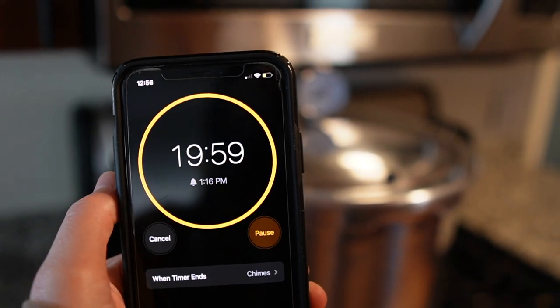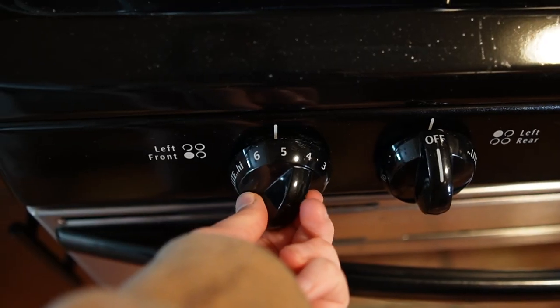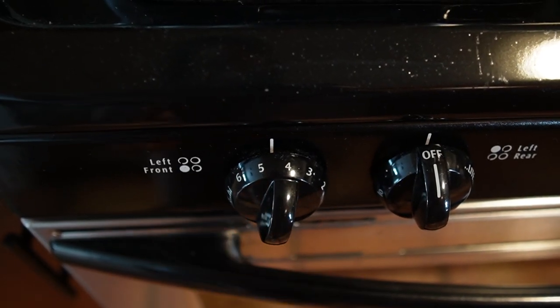Once the rocker begins to shake, set another timer for 20 minutes. At sea level, the internal temperature of the pressure cooker at 15 psi will be 121 degrees Celsius. You'll need to adjust the burner heat up and down to keep the pressure around 15 psi. If the pressure starts to get too high, just turn down the heat and the pressure will start to lower.